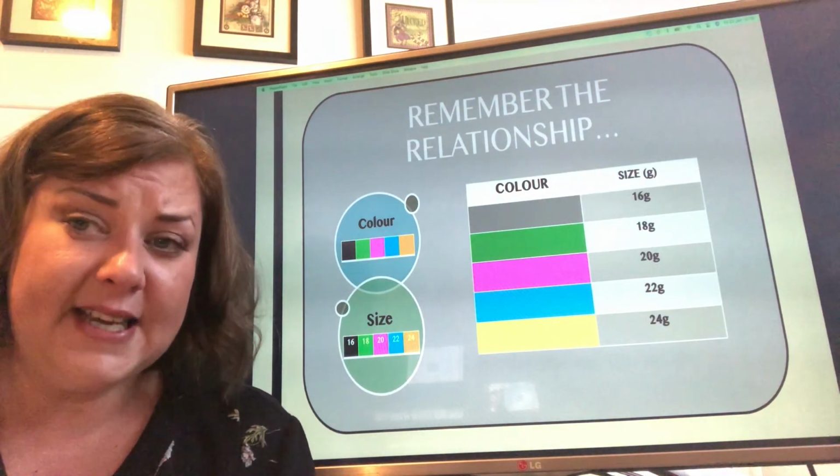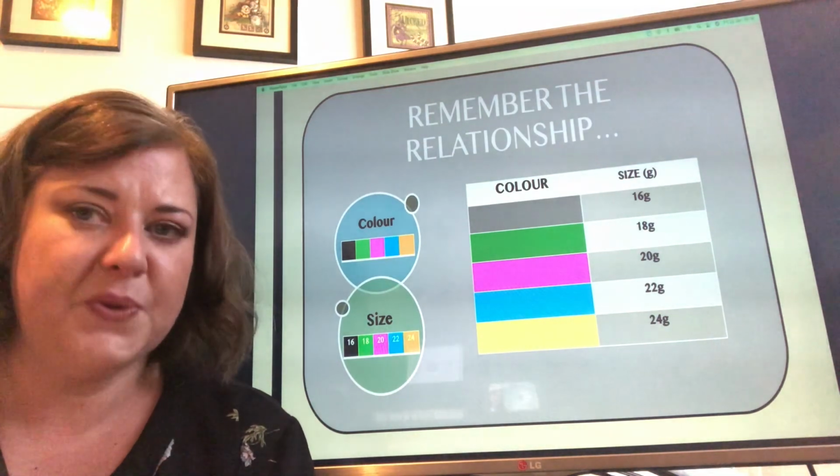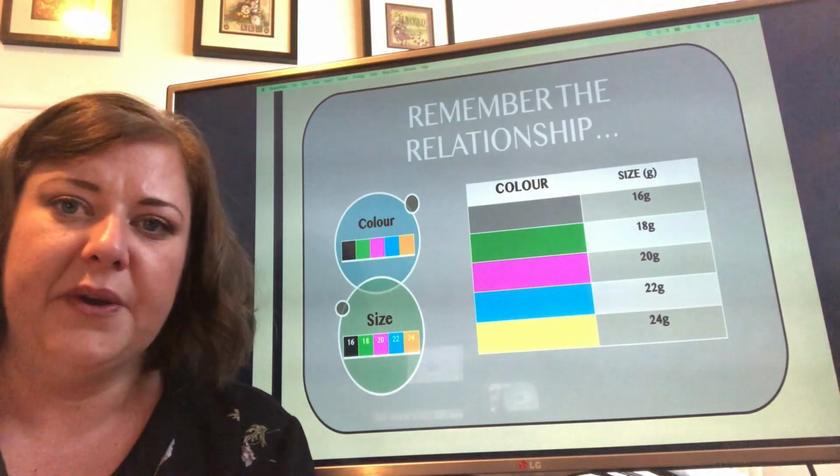Grey is 16 gauge, green is 18 gauge, pink is 20 gauge, blue is 22 gauge, and yellow is 24 gauge.